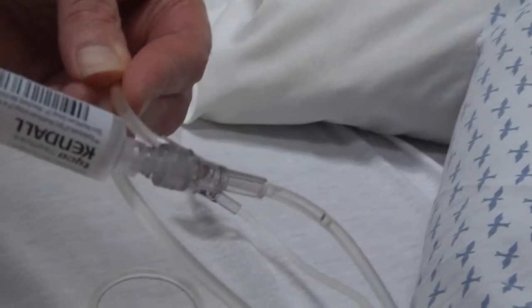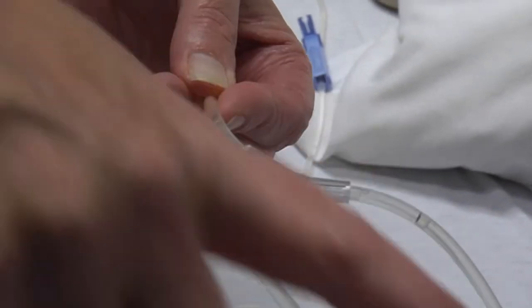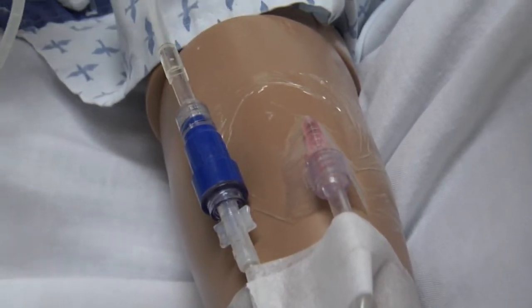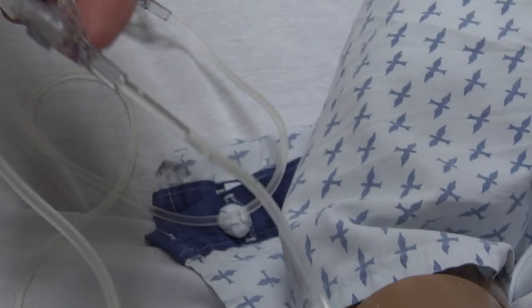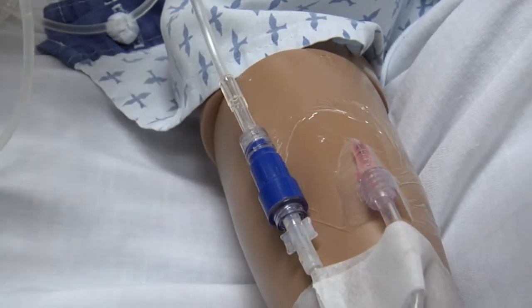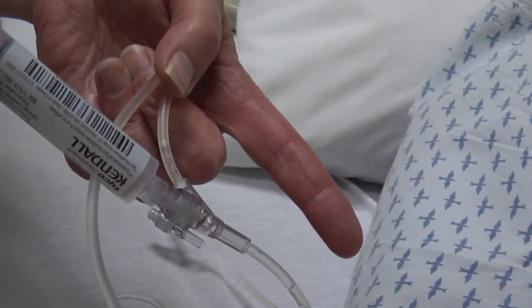And in this case, I would check to make sure if we have a blood return. So right here is where I would be looking for a blood return. I'm going to pull the plunger back, and if this was connected to a real patient, you would see blood that's coming up into this tubing. That would indicate that the IV is actually in the vein and it is running.